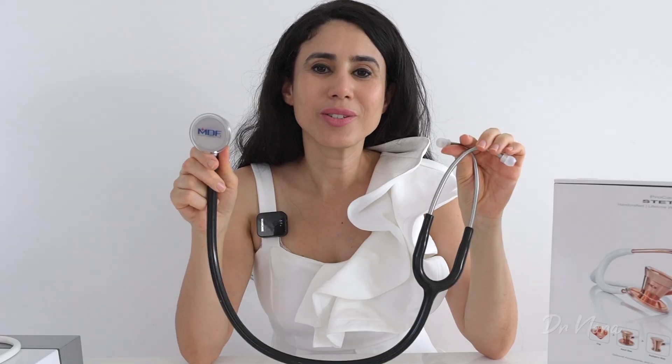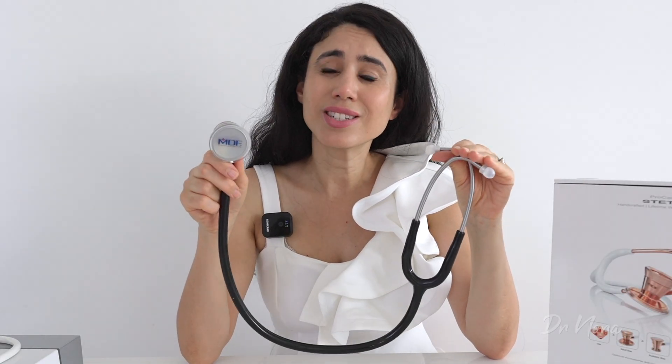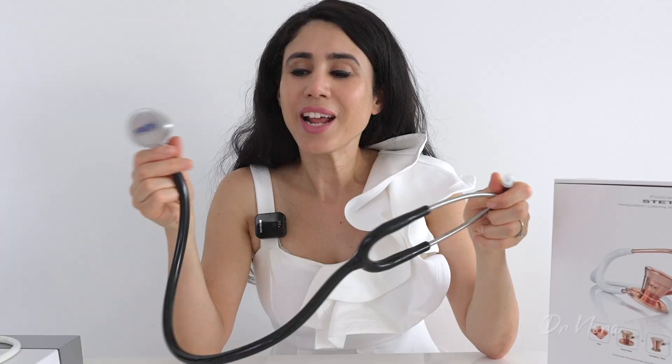So there you have it — that is the Procardial Stethoscope by MDF, and I've got to say I am pleasantly surprised by it. I'll be interested to find out how it compares with the Littmann Cardiology Stethoscope and the Littmann Classic 3, so stay tuned for those videos. I hope you found this useful — if you have any questions or comments, join me in the comment section below. Take care and stay healthy.